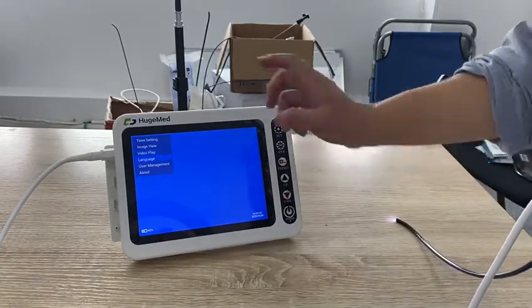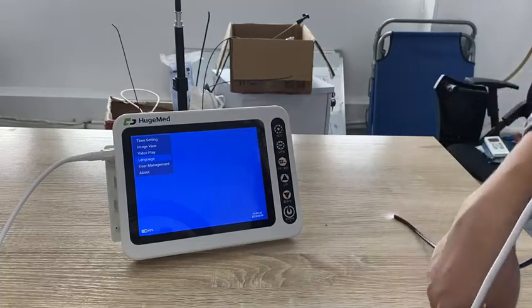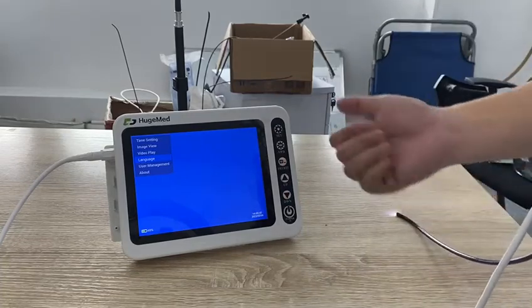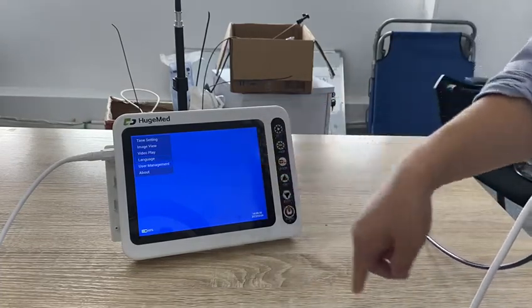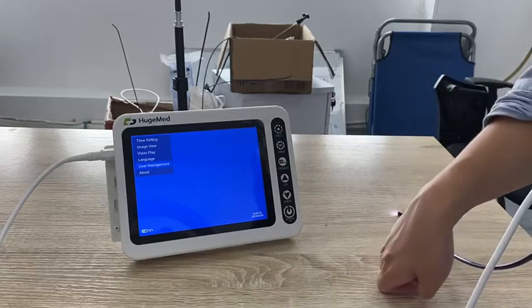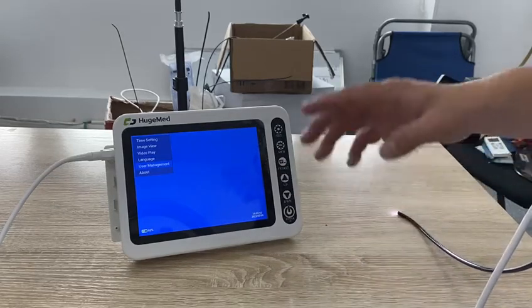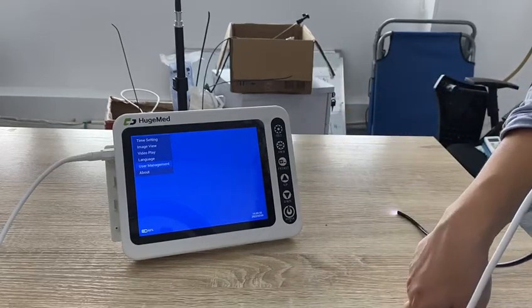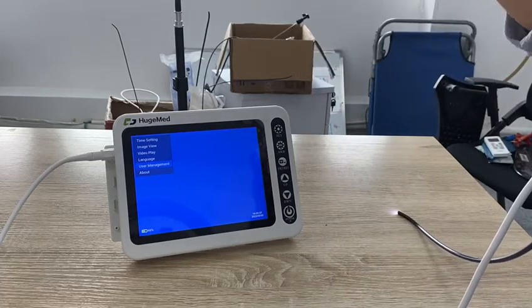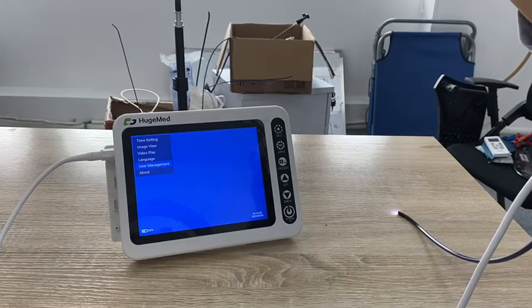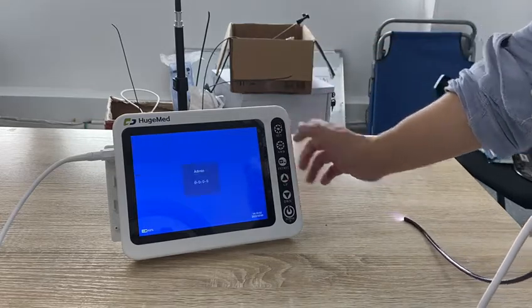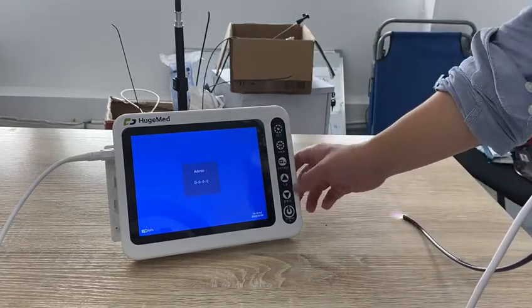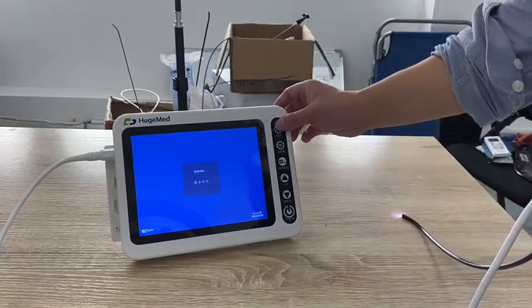For languages, we have English and Chinese as options. There is also user management — you can log in and set up all the accounts. You can assign accounts to your doctors, and only doctors with accounts can log into the system.